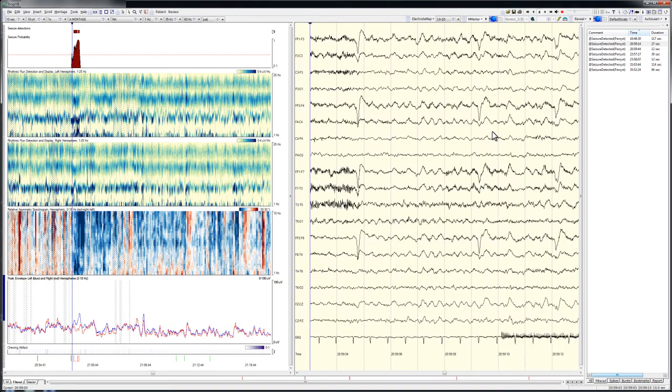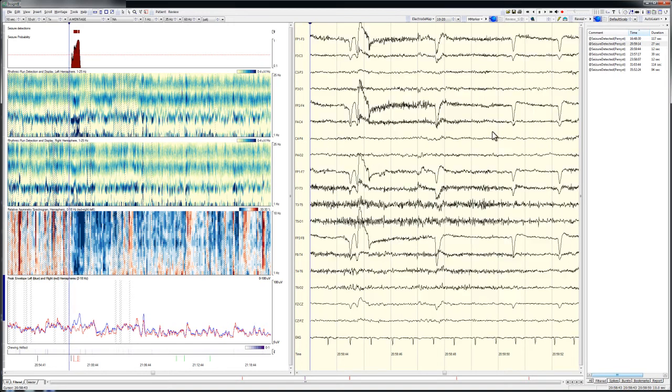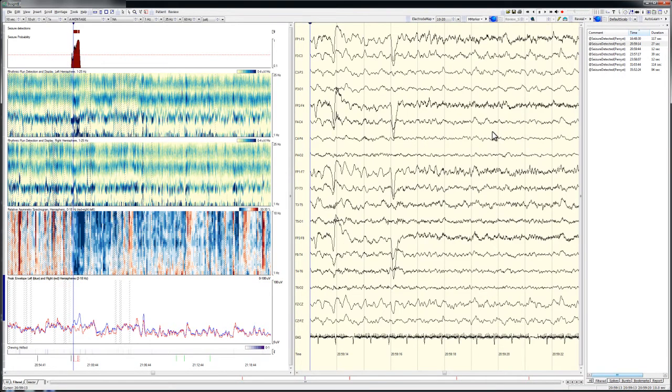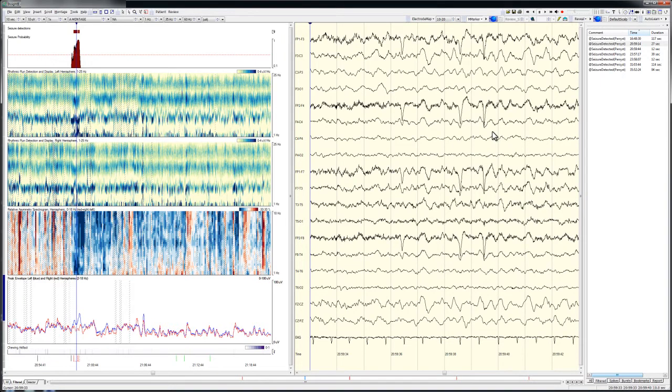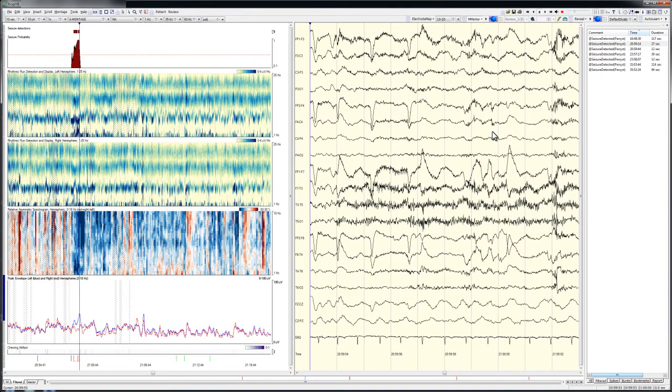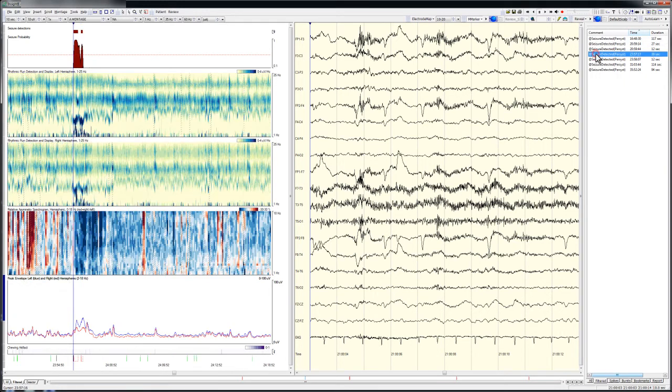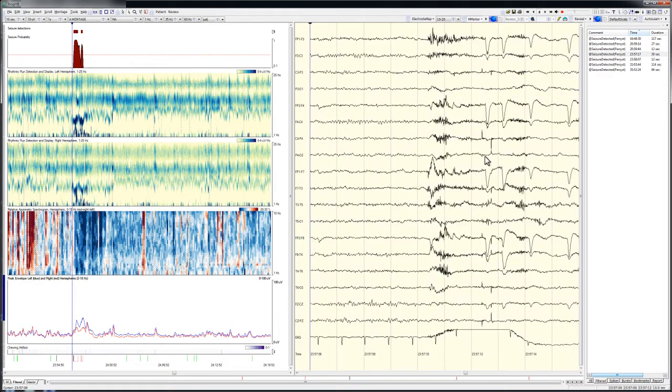Clicking just before the prominent trend changes and then paging forward through the EEG allows immediate confirmation that this is a seizure, and that its evolution differs from that of the seizure just reviewed. As suggested by the trending graphs, the seizure is more confined to the left and generally has lower amplitude as compared with the first seizure.